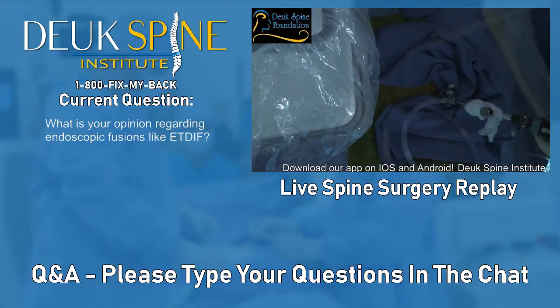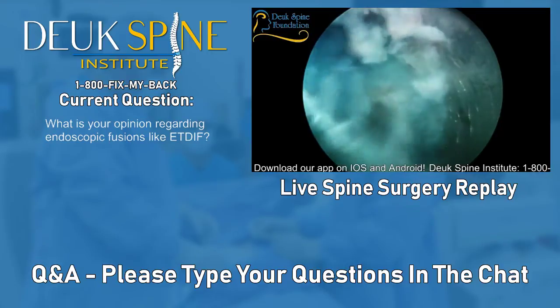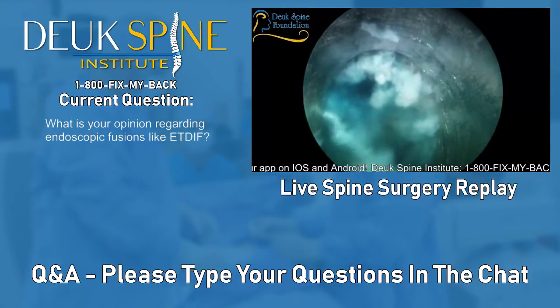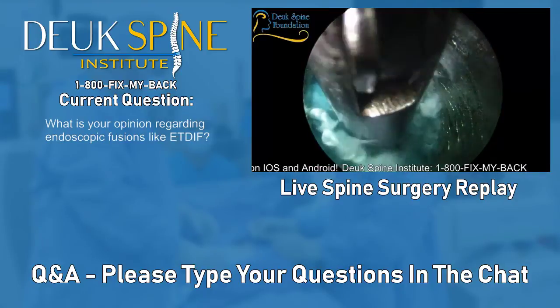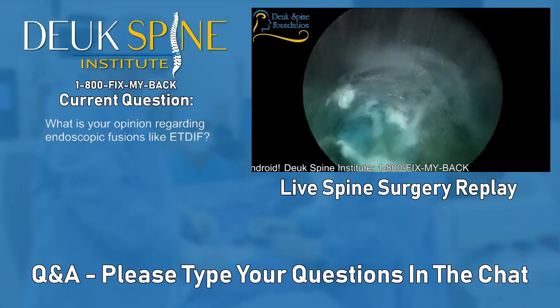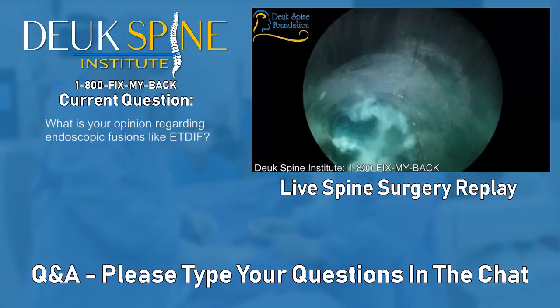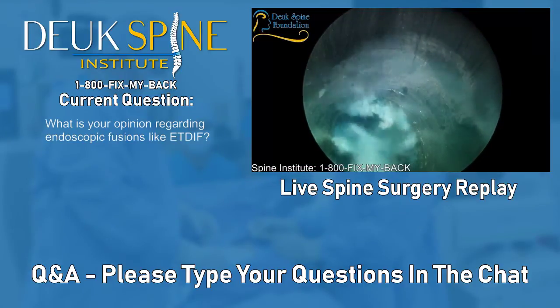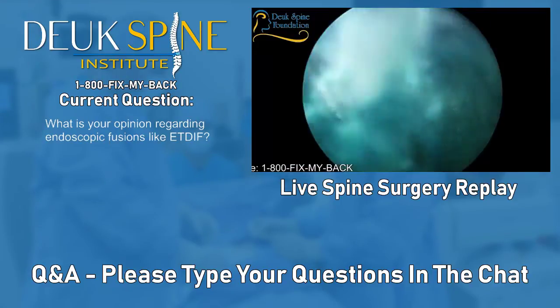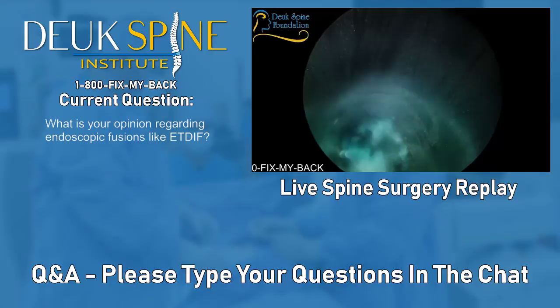So what are those goals? Well, if somebody has a herniated disc with back pain or neck pain, your goal is to debride the annular tear. Quite simply put, debride the annular tear. If you can do that and unpinch the nerve, if it needs to be unpinched, then that is the best result possible you're going to get for the patient if you do it endoscopically. And that's done without fusion.